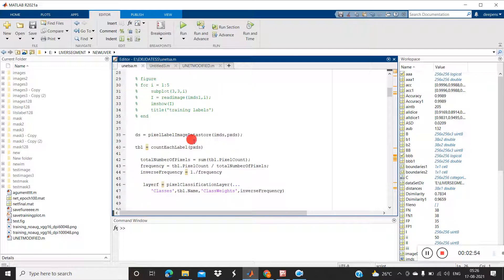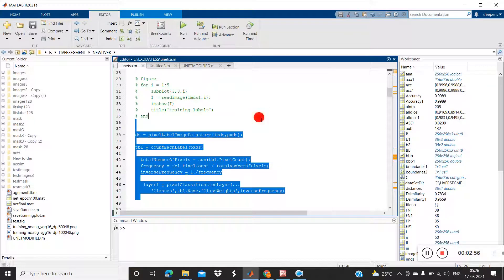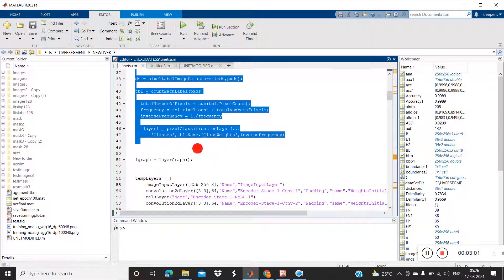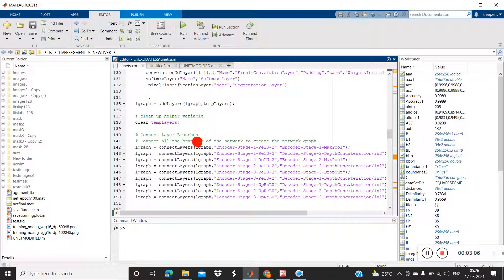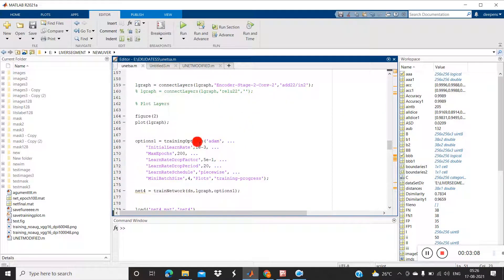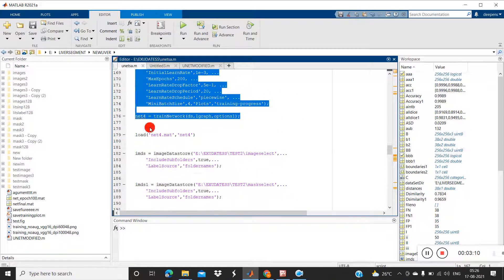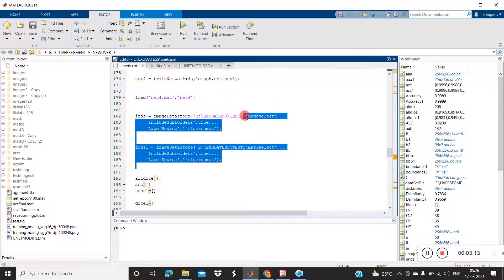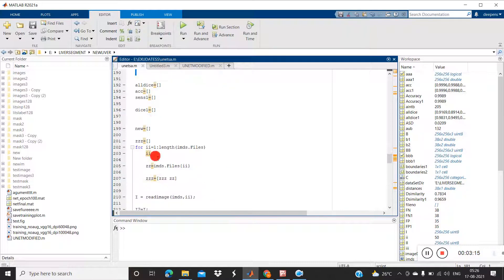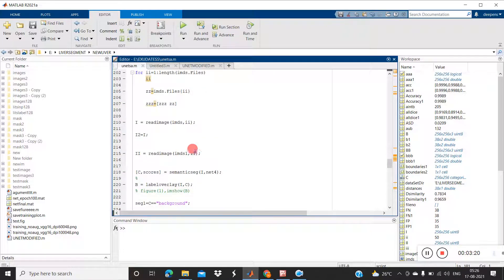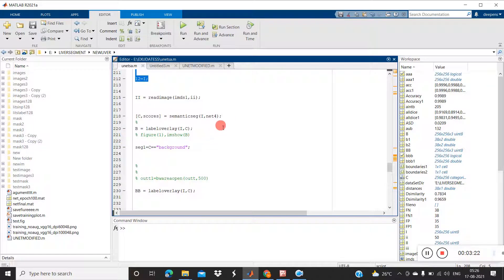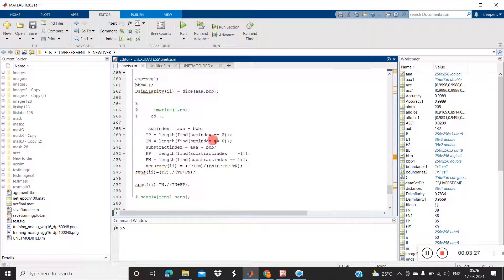Then take the pixel image data store. After that, count the number of pixels and the frequency related to background and foreground. Then take the layer graph and construct the layers. After that, connect all those layers. Then give the training options and train the network. Then test our input data — once the input data is loaded we can test it, read those images, do the semantic segmentation, and finally produce the result.